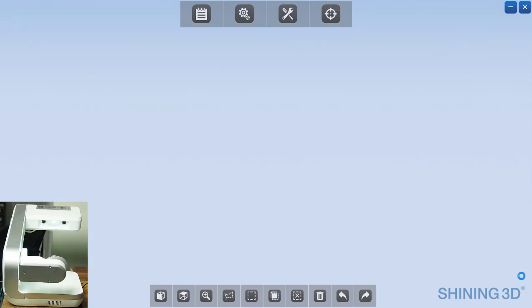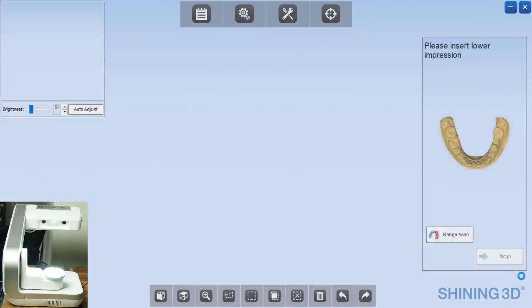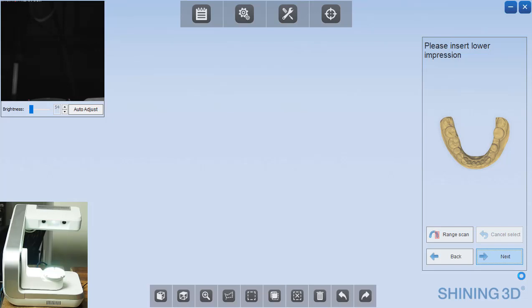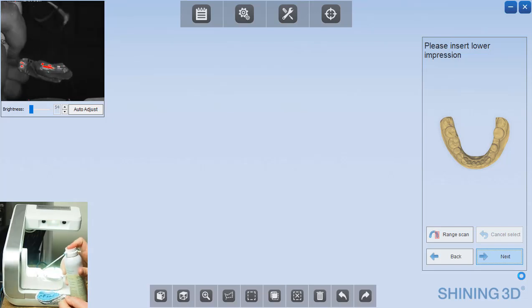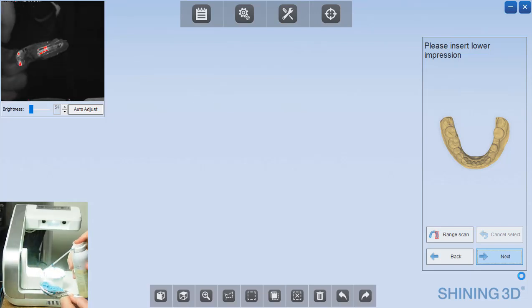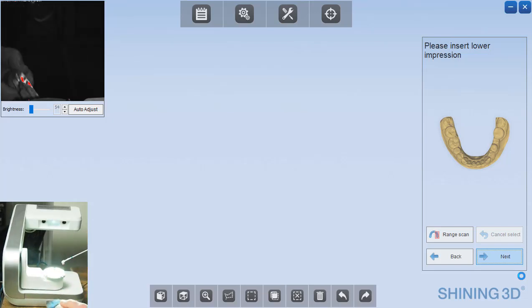Click next and the scanner will go through a few initial movements as it starts up and it's going to ask you to insert the lower impression.